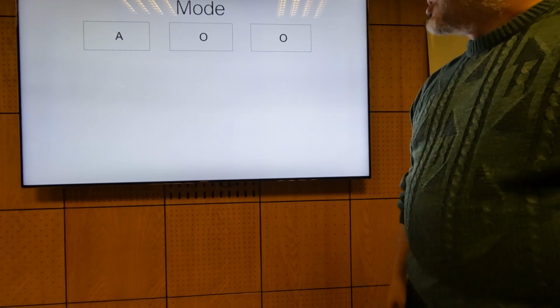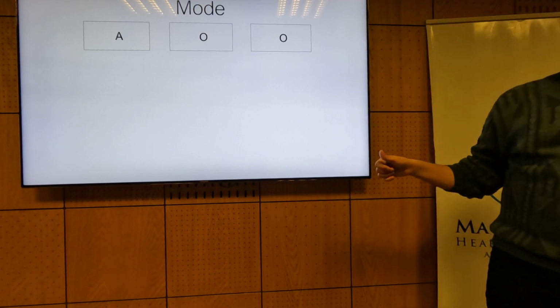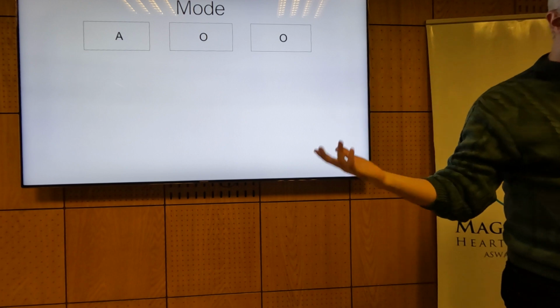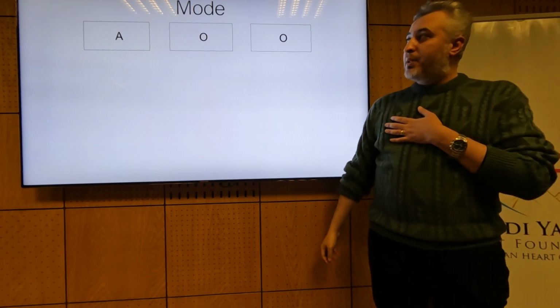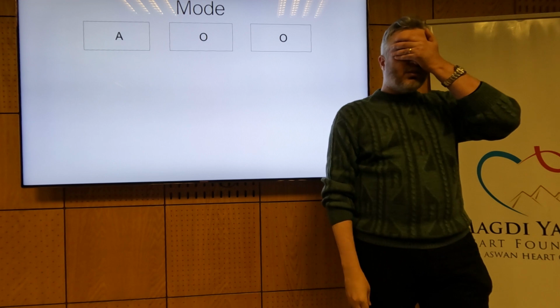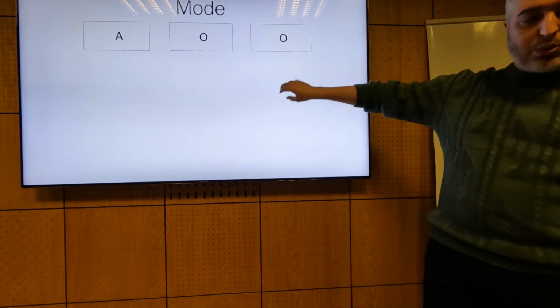Okay. So we move to the next mode, AOO. What are we pacing? Atrium. What are we sensing? Nothing. None. What is the response of not sensing? Nothing. So now the pacemaker is connected to the atrium, has its eyes shut, and keeps pacing. It knows nothing about what is happening in the atrium. Okay? This is essentially what we're doing here.